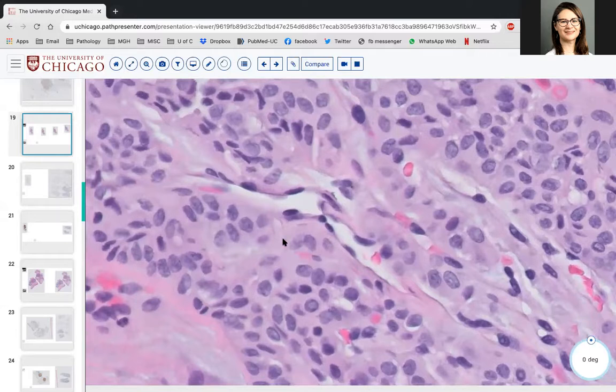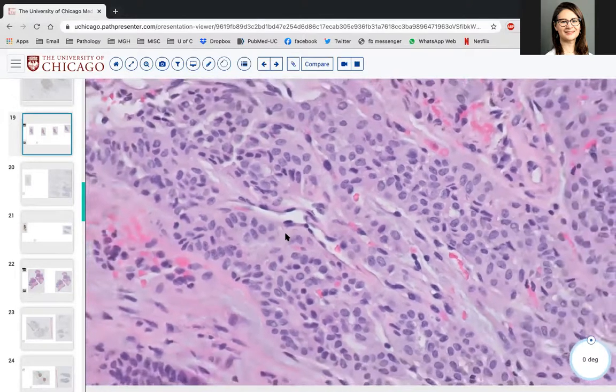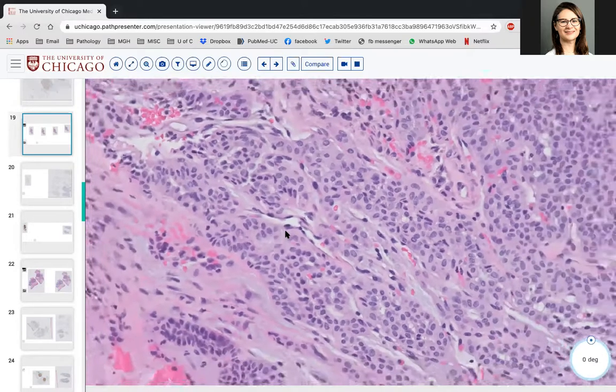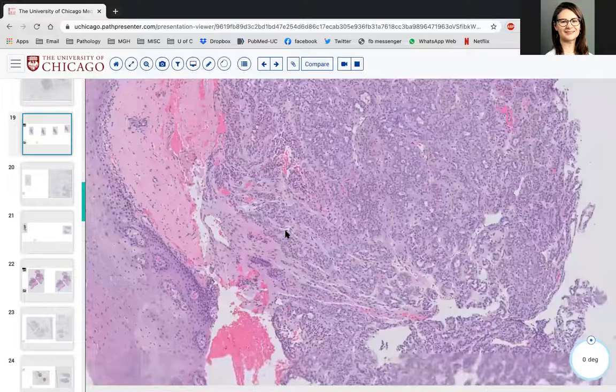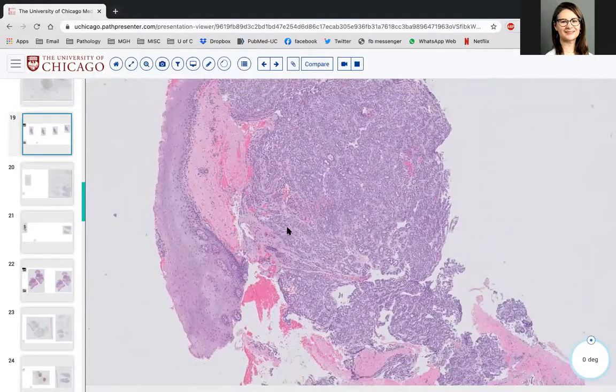Questions, comments? Remember, polymorphous is most commonly seen on the palate, but is not the most common tumor of the palate. And in this case, where did it come from? Retromolar pad. Yeah, so kind of nearing the palate. Any other comments?